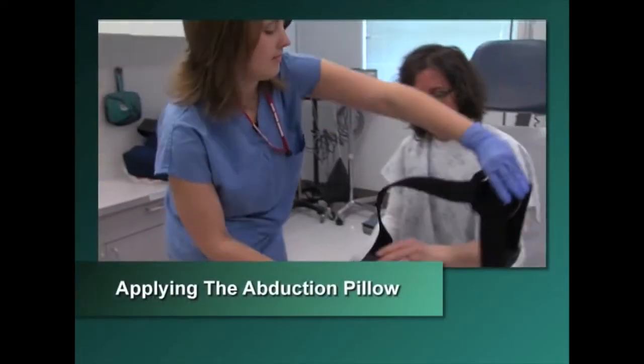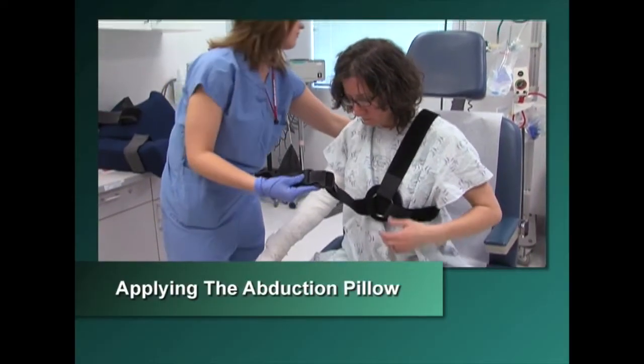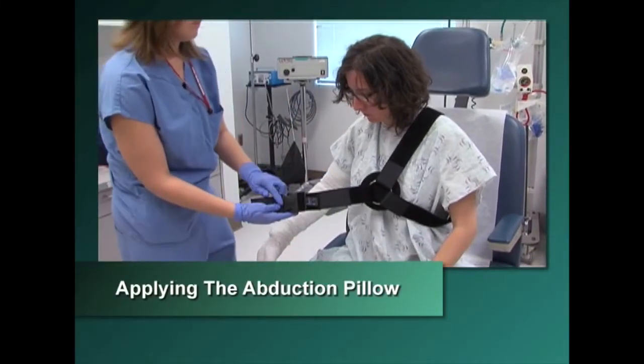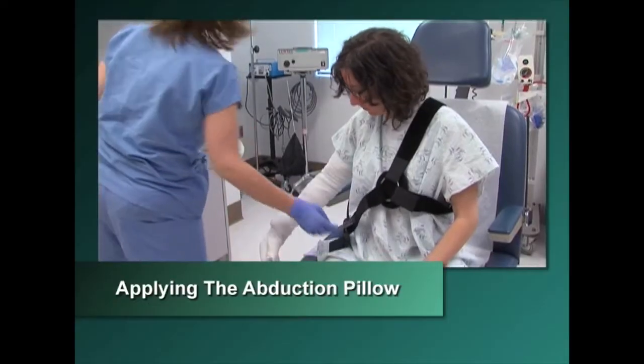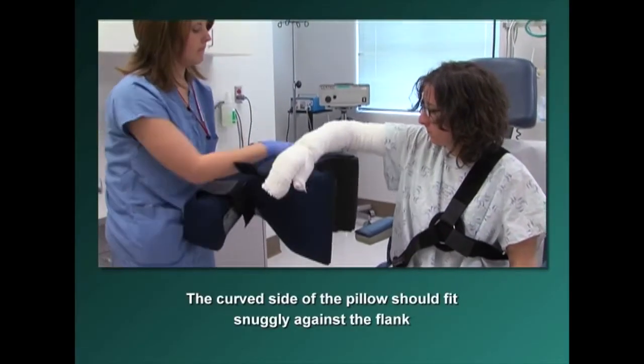To apply the abduction pillow, the patient may require assistance into the appropriate position for placement of the pillow if he is having pain or stiffness in the joint. The curved side of the pillow should fit snugly against the flank.